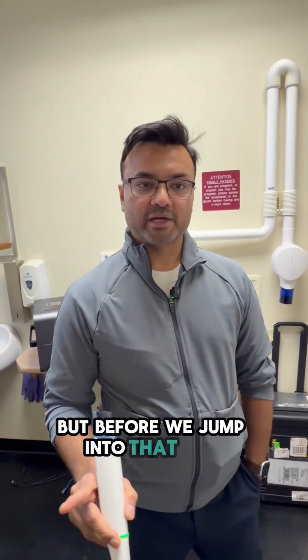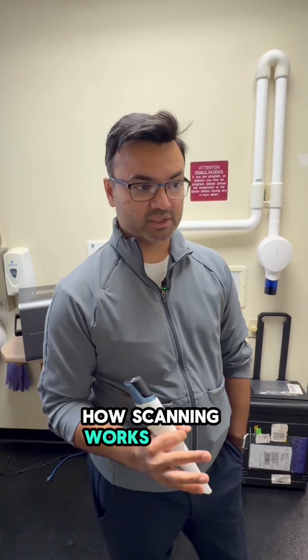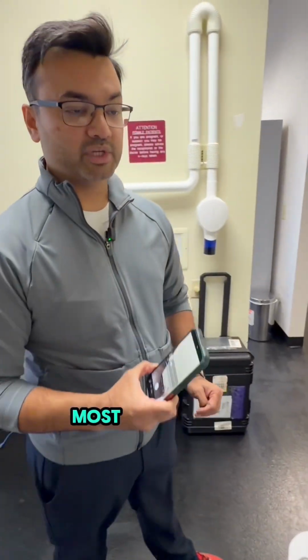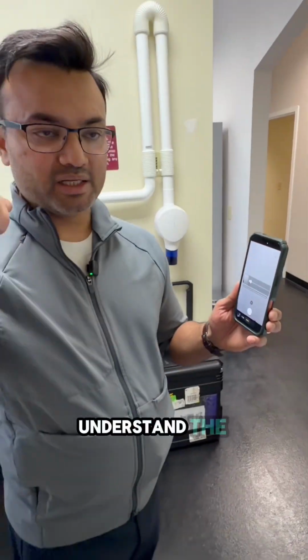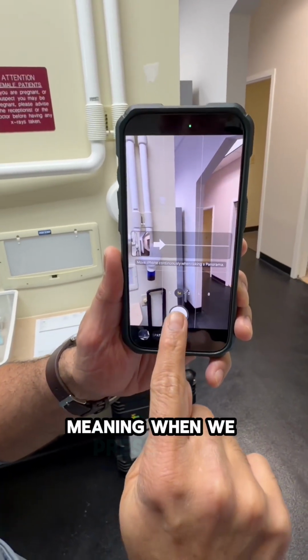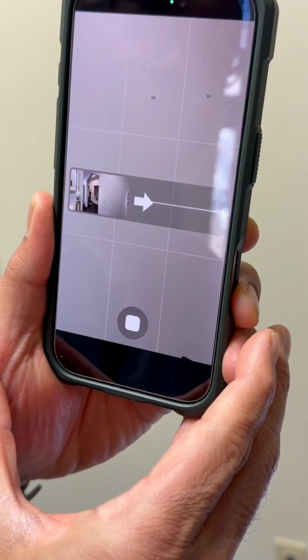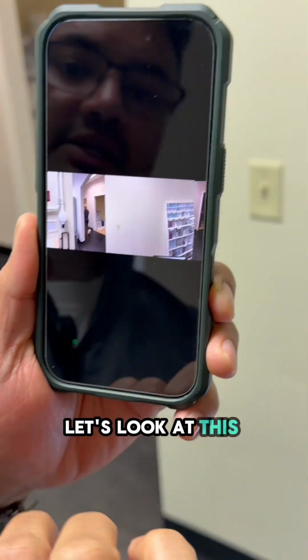But before we jump into that part, let's break it down into as simple as possible how scanning works, how a camera works, how the software works. Every person by now has seen a camera with a phone. Most cameras are going to have something which is called a panoramic picture. Understand the concept about how a panoramic picture works. You see this arrow right here, meaning when we press start, and a panoramic image means it's going to take a really long image. By doing this, it can keep going. When we stop, let's look at this picture.